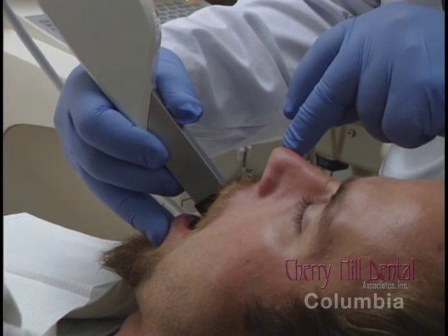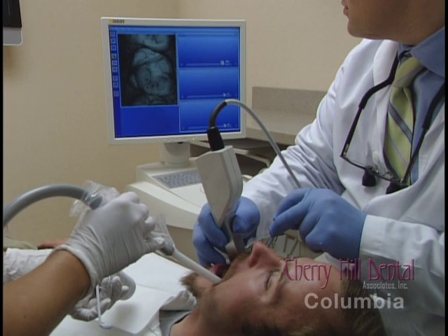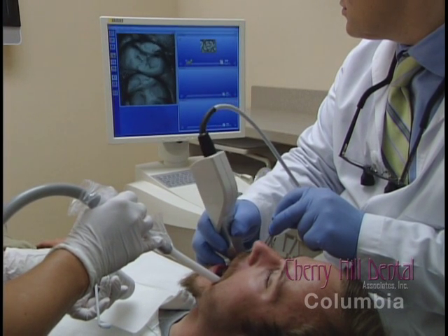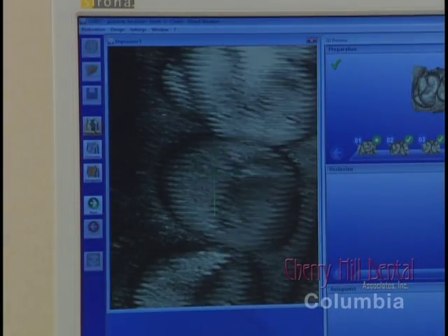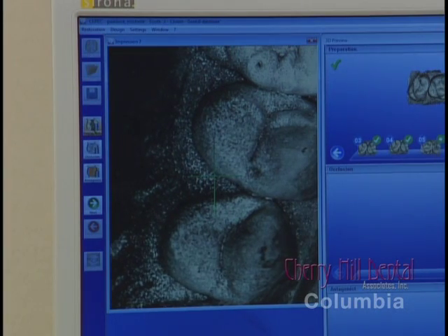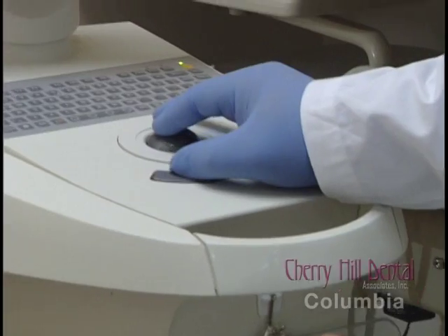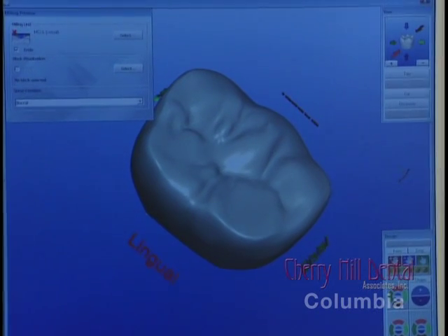Well, one of the technologies that I use on a daily basis is called CEREC. The CEREC technology allows me to take a camera and scan the prepared tooth, transmit that data to the computer, where I can sit chairside with the patient, design the restoration completely, and send that information 2 rooms away to a machine that mills the restoration. In about an hour I can provide the same exact restoration that might take a lab 2.5 to 3 weeks to provide via the mail.